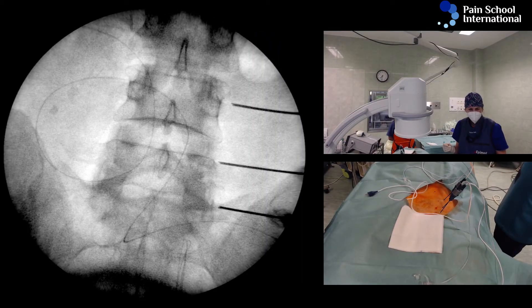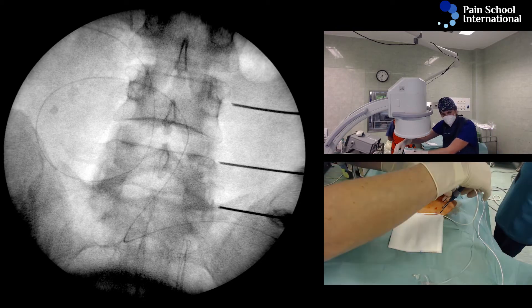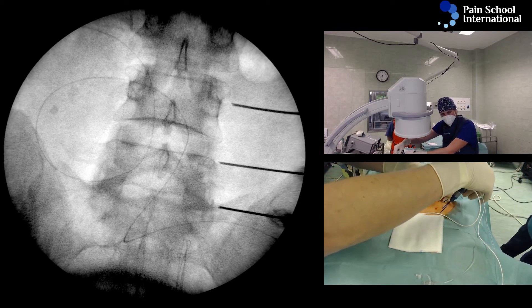What can we see? The L5 dorsal ramus is probably good. The L3 I would say is a bit too lateral — I need to walk it a little more medial and advance.